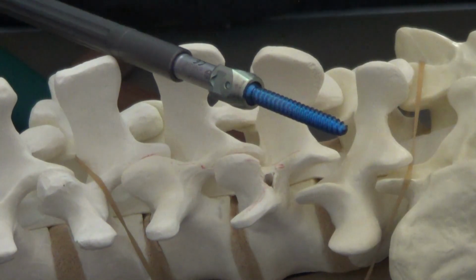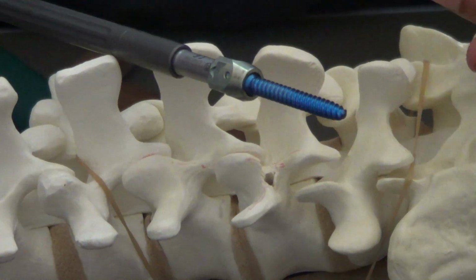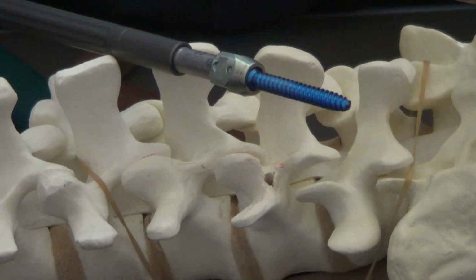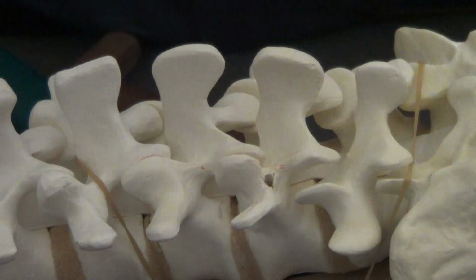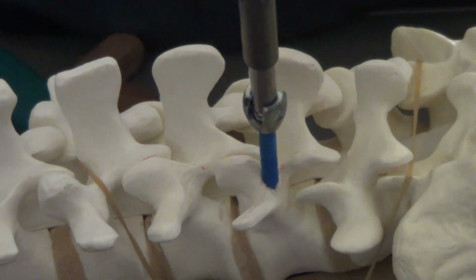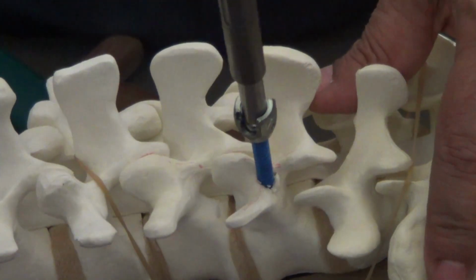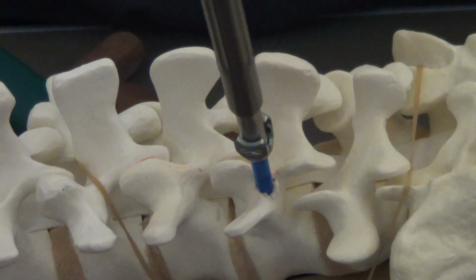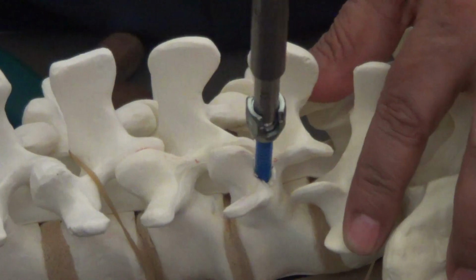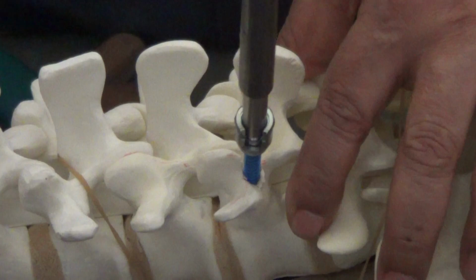Again, you see the lateral view of the X-rays, and you'll be able to decide what your screw size is. So, in the lumbar spine, 6 millimeter, 6.5 millimeter is a good screw. Now, the other thing is that you got to angle it in slightly, and this is a ratchet here. So you just have to turn half. You don't have to go all around turning, because you'll land up with a tennis elbow, right? So you gently go half turn, and you'll be able to insert the screw in.